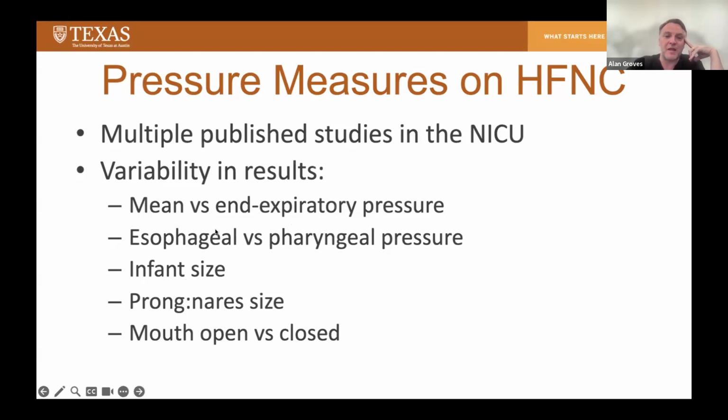But the bigger differences, I think, that we're seeing are the infant size, depending on the flow rate that we use, in particular, the size of the prong compared to the size of the baby's nose, and also whether the baby's mouth is open or closed at the time of the study seems to have a significant impact on pressure generation.